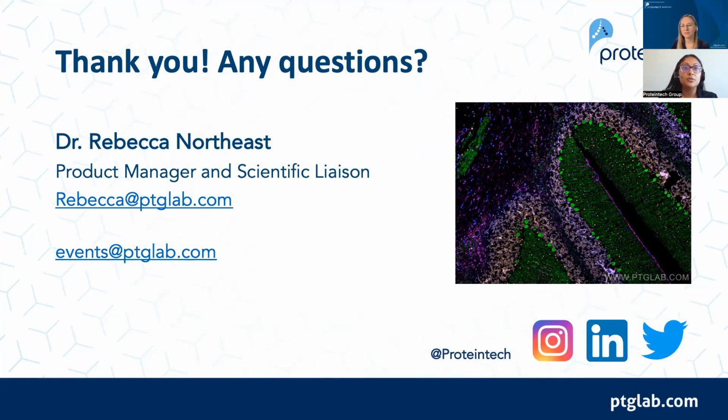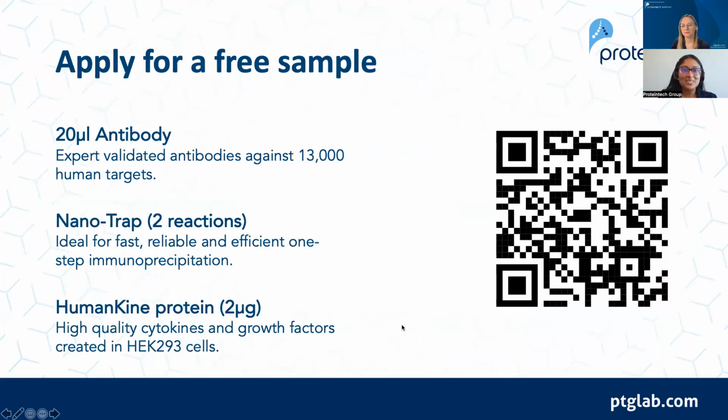Yeah, and to add to that, sometimes you also want to look at your buffer too, because in certain situations, detergent can be your friend, and in other situations, it can be really detrimental. So if you're looking at more of an extracellular protein, maybe you start off with less detergent and then titrate and work from there, and see what detergent concentration is good for your buffer in order to see your protein of interest. But with a lot of these questions, you wish that there was the perfect answer, but a lot of times it's not. It's a lot of trial and error.